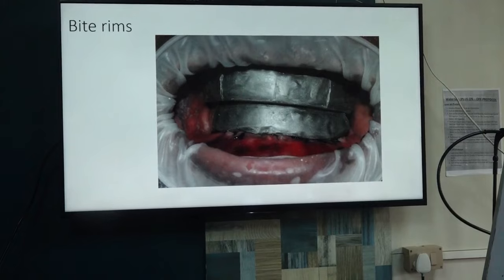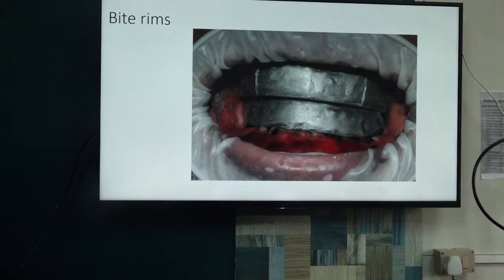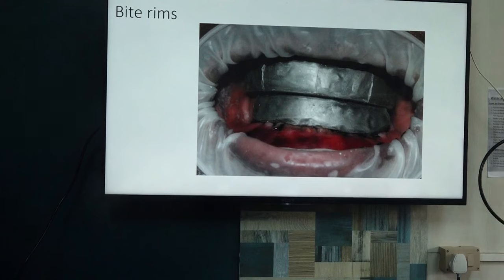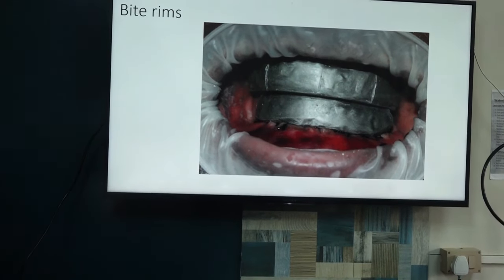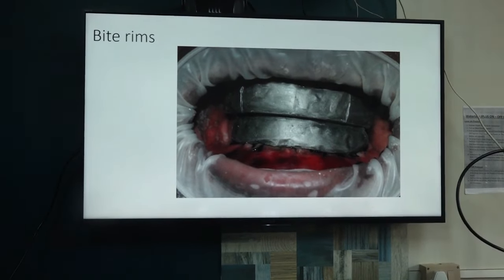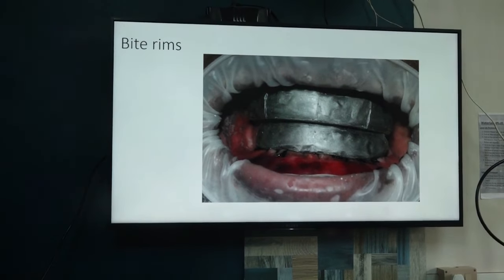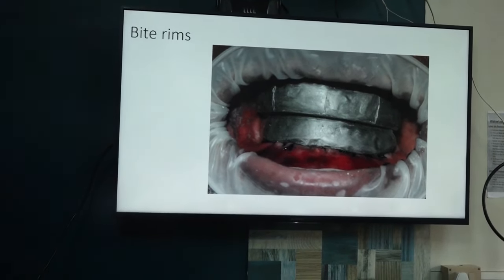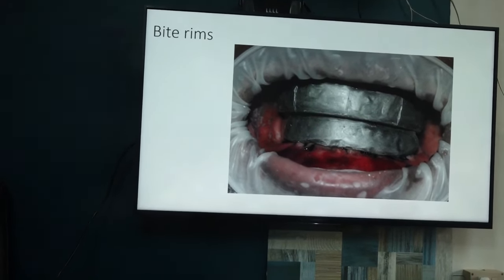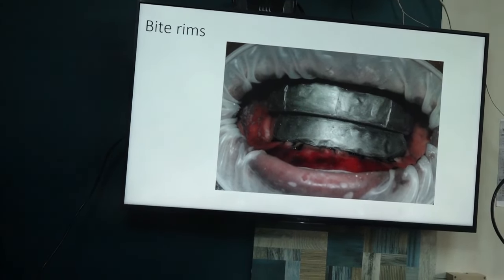The photo is slanted, right? Don't forget to put the midline and canine line. If you don't do it, then you have to start again. Big headache, because you are going to do an important step here. You have to do upper bite rim scanning, lower bite rim scanning, and the jaw relation bite rim scanning. If you do everything else and then come to know that you didn't put the canine line and the midline, then you have to do it again. Do it properly. Specialist will do slanting, but you have to do straight.